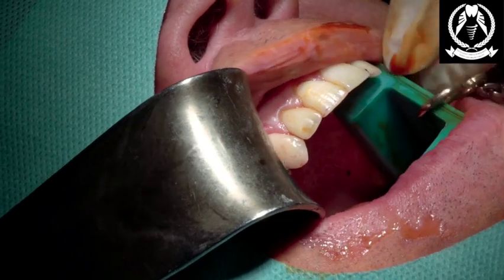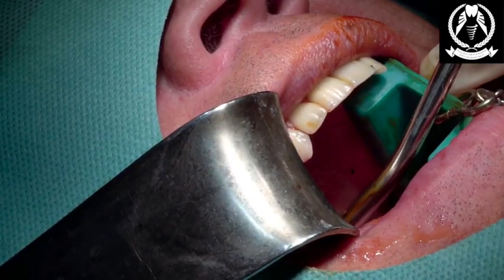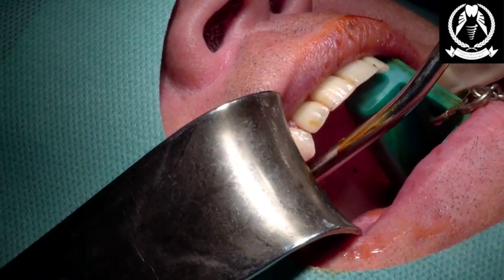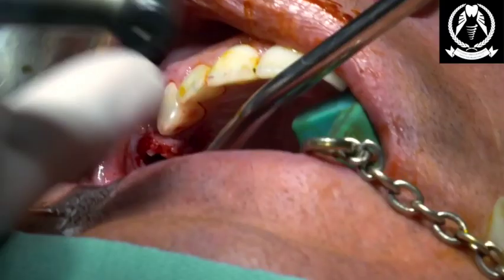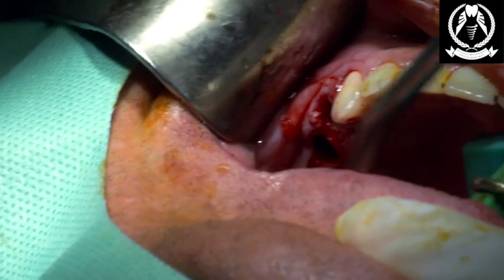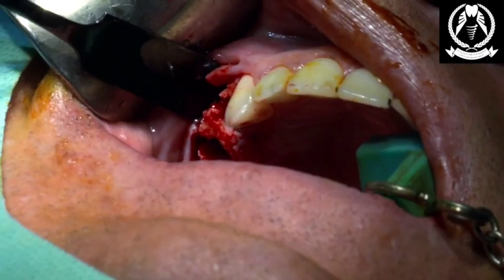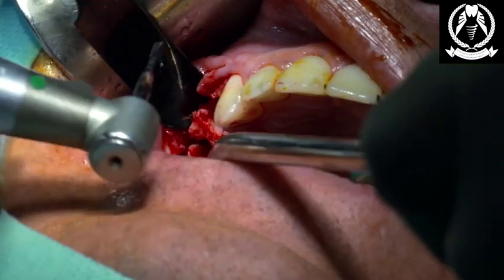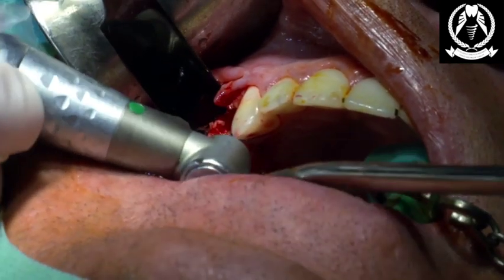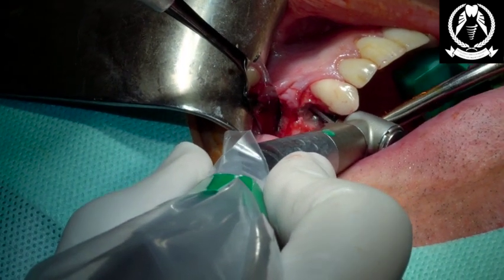That's awesome. So that's getting into the right direction. That's amazing. And we're just going to... Alan, if you move that slightly that way, cheers, buddy. Right, you've got the drill extender. I'm just going to hold that there. You pull that. Got it? Okay, and we're just going to correct that to that angle there.